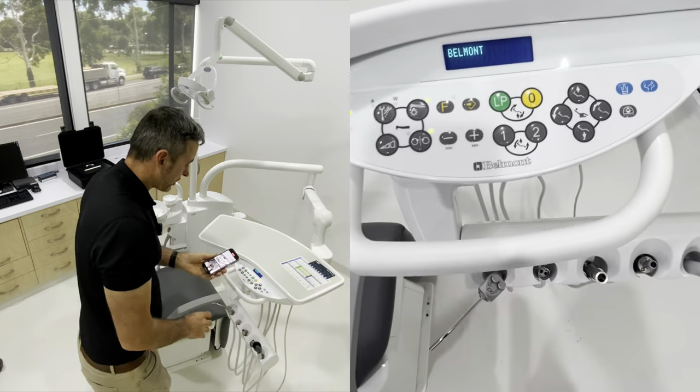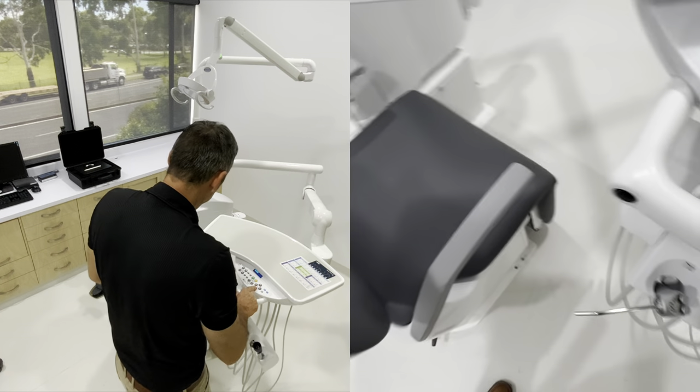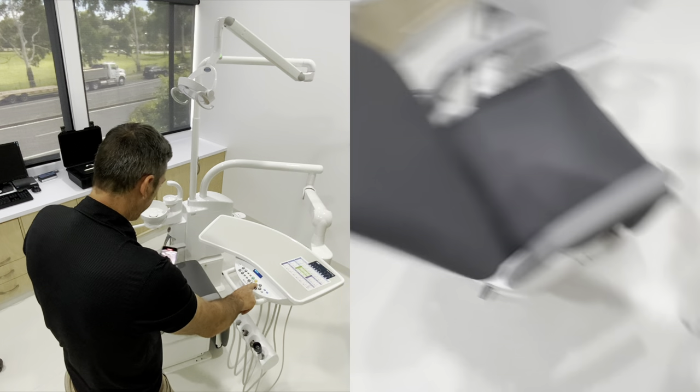Up here on the doctor's tray we've got manual movements: chair up, chair down, back rest up, back rest down.